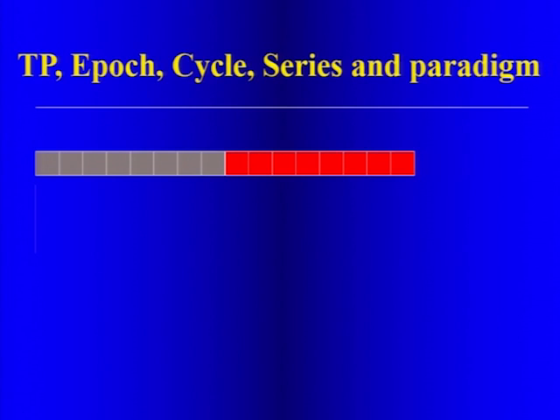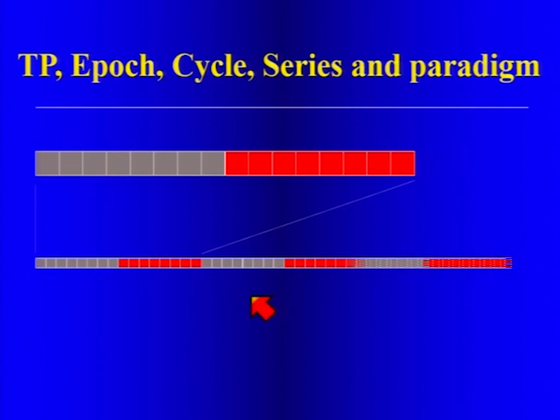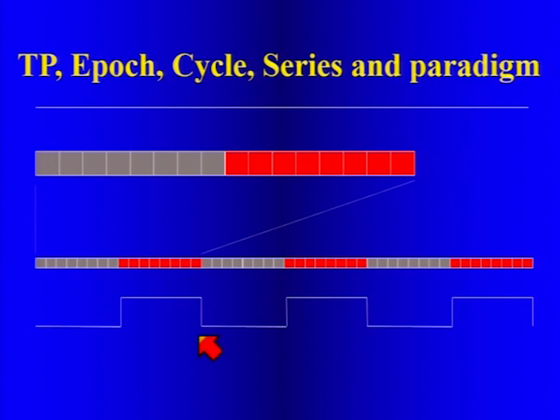So for each task, we usually do 6 epochs, and we do an on epoch and an off epoch, and we repeat this 3 times, and this gives us this block paradigm technique, and this is what we do when we ask the patient to do a task. We'll ask them to do something, do a rest, do something and do a rest, and then in the post-processing, we take all of the on and we subtract from it the off, and we get the positive BOLD. If you want negative BOLD, you reverse it.